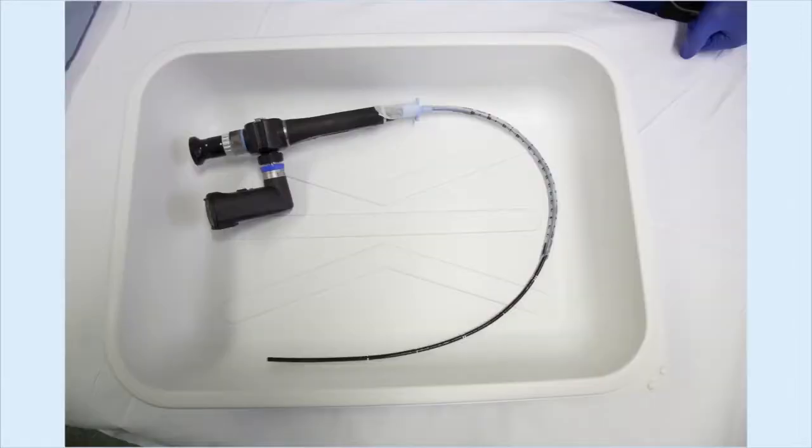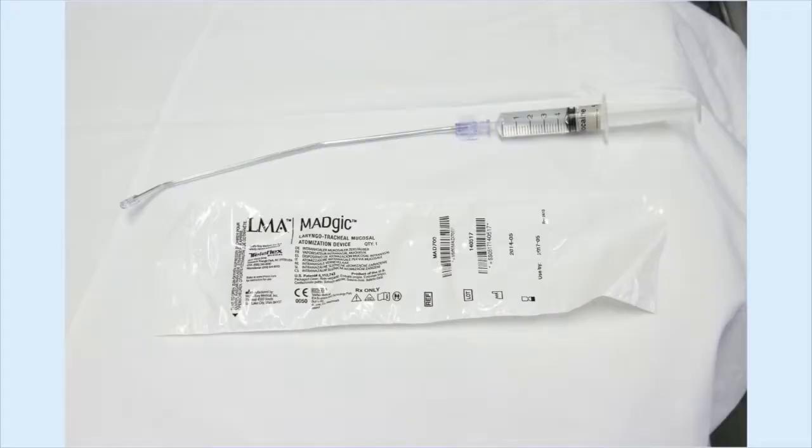Where mouth opening is restricted, fibre optic nasal intubation is preferred. In patients with a known difficult airway, having a fibre optic scope available and ready to use is an essential backup plan. Preparing the airway with atomized local anaesthetic spray is useful to allow the patient to maintain self-ventilation and avoid laryngospasm, whilst passing the endotracheal tube through the vocal cords.